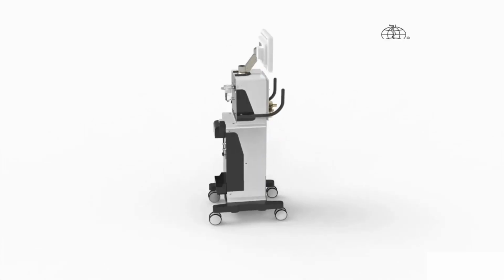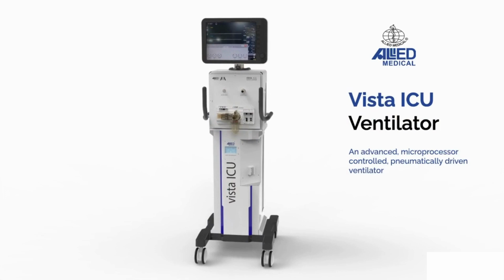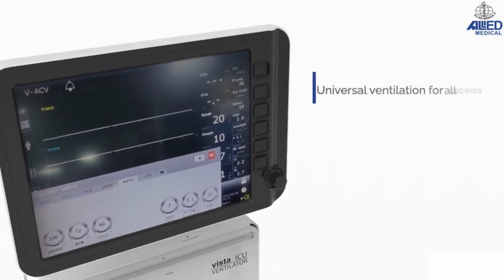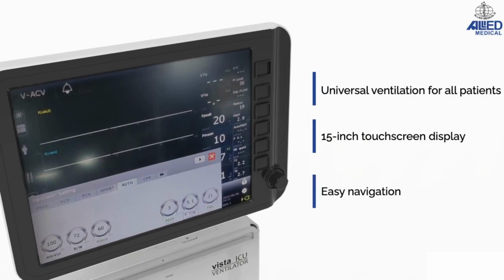Allied Medical Meditec presents Vista Ventilator, an advanced, microprocessor-controlled, pneumatically driven ventilator. The Vista Ventilator is designed to provide universal ventilation for patients of all ages, from neonates to pediatrics and adults. A generous 15-inch touchscreen display revolutionizes the way medical professionals monitor and analyze patient data. With its intuitive touch interface, doctors and nurses can easily navigate through its various functions and settings.